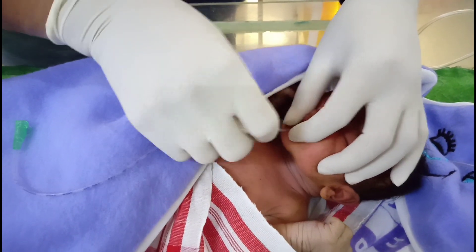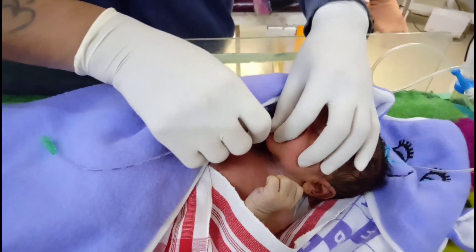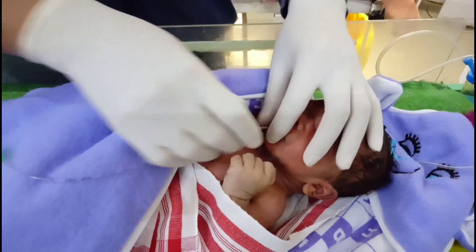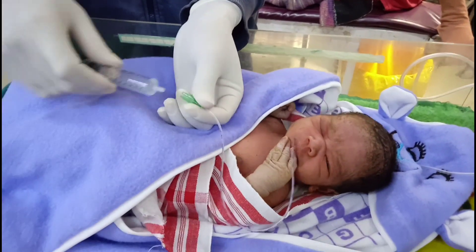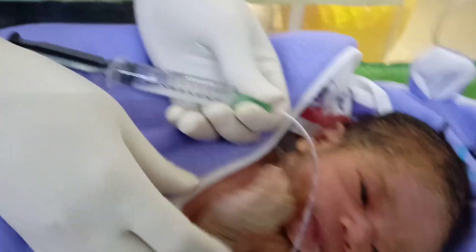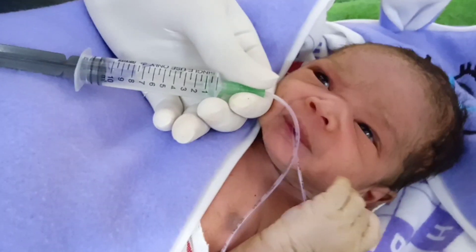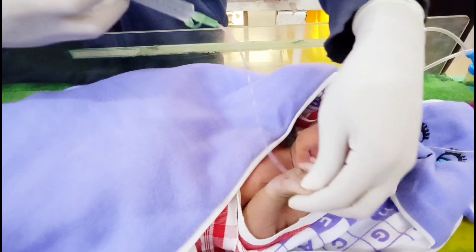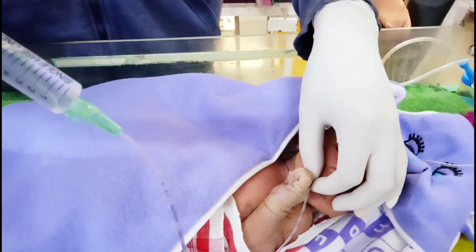Here we are inserting the feeding tube. Now we have to push the normal saline that is in the 10 ml syringe into the stomach.